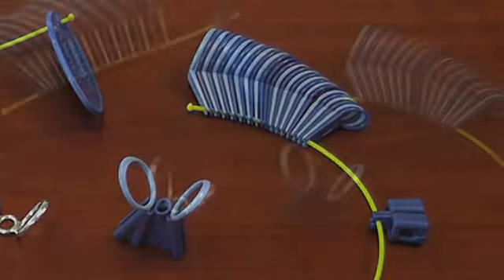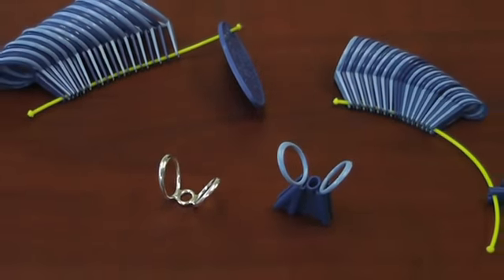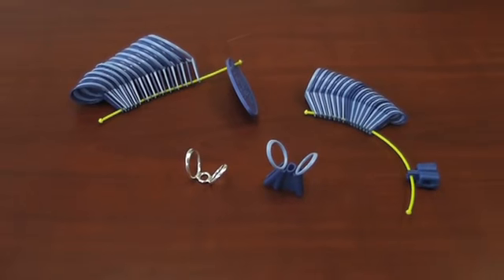The boutonniere holder is used to put two easy-sizer rings together to form a trial plastic splint to slide on the finger.